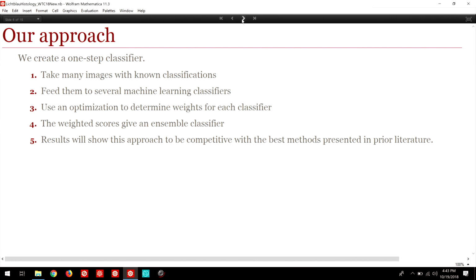Then we had the opportunity to use Mathematica. We had a lot of options there. There was this function that I found really magical, Classify, which actually accepts anything: numerical data, images, even sound files. And it could classify images. So we tried several options here, many classifiers for these images.